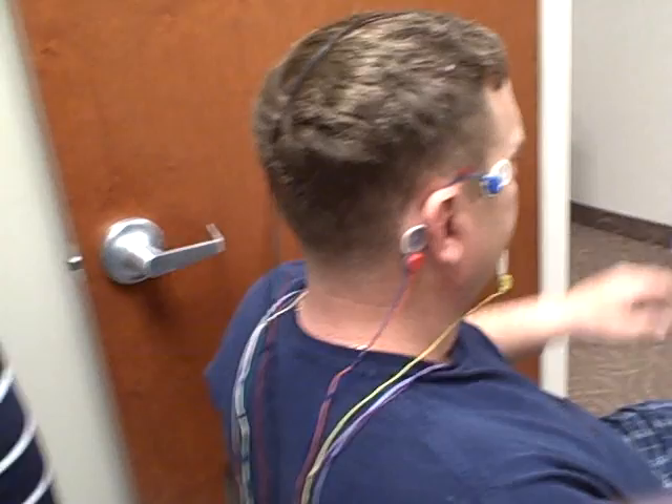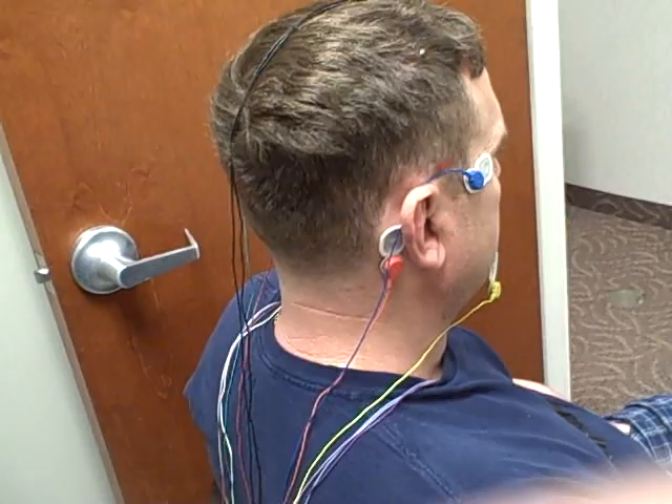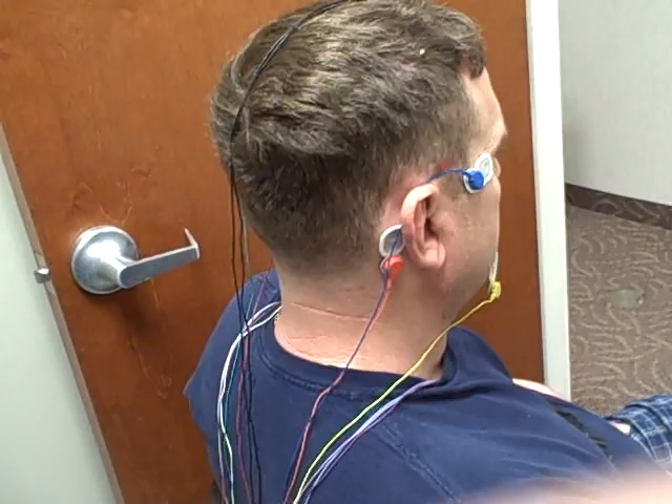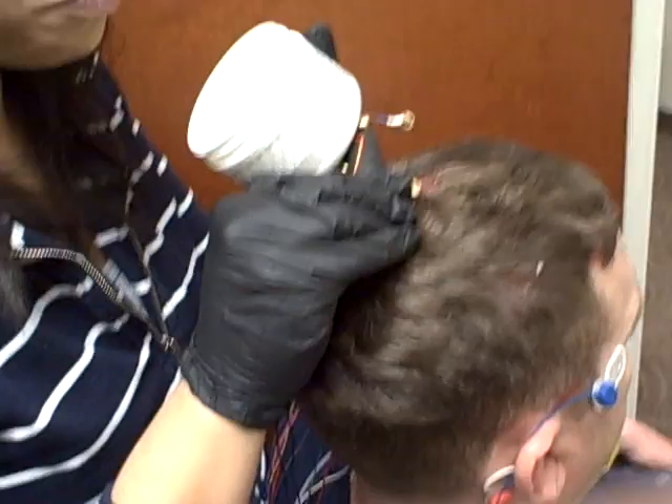Our next step is to use our 10-20 paste. What we're going to be attaching is what we call gold cups. Basically what you do is scoop the 10-20 paste to fill the cup, then press down on the head. As you press down, the 10-20 paste will make an adhesion and also push some through the center of the cup — that's how you know you have a good connection.